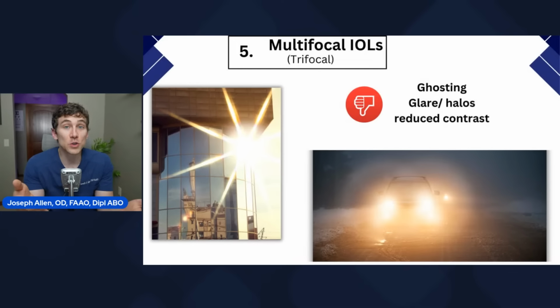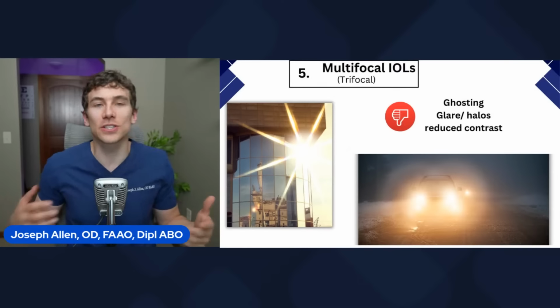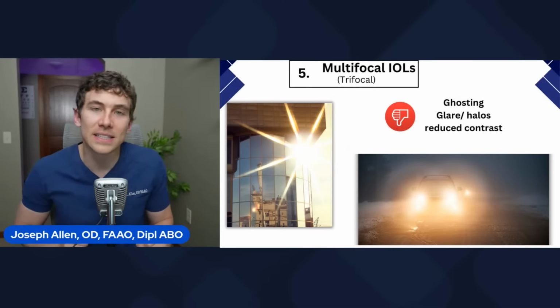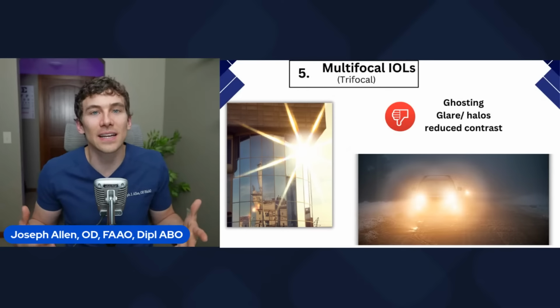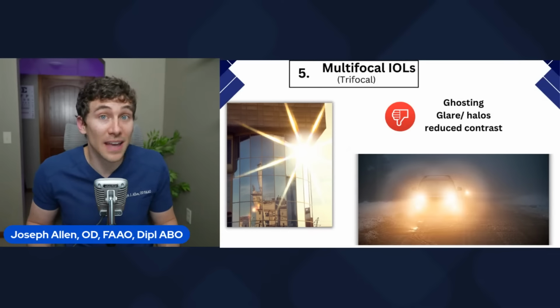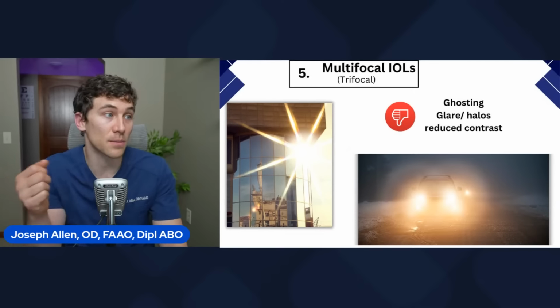I think for individuals who are a little bit more relaxed and are not really bothered by that, you're really just enjoying having clear eyesight. You maybe don't drive at nighttime too often, and these little things of glare are just not that irritating to you. If you've never suffered from problems with glare or ghosting, then multifocal IOLs can be, I think, a game changer for a lot of individuals thinking about cataract surgery.